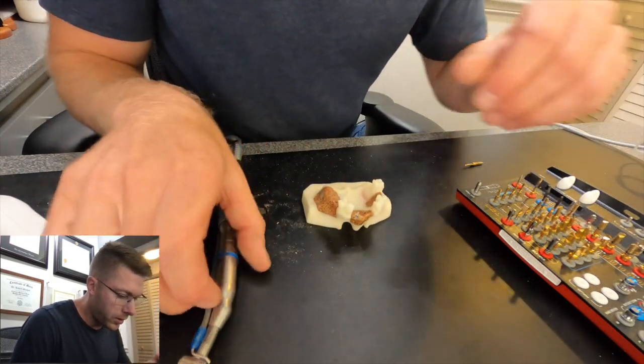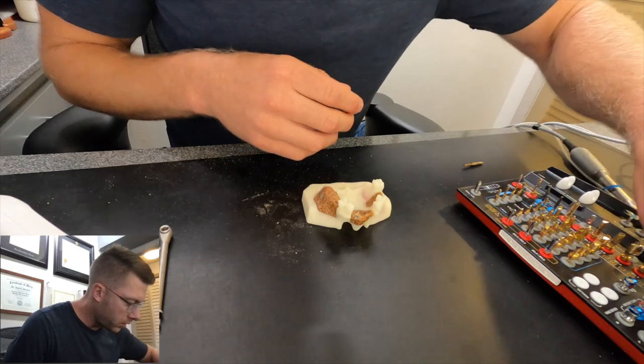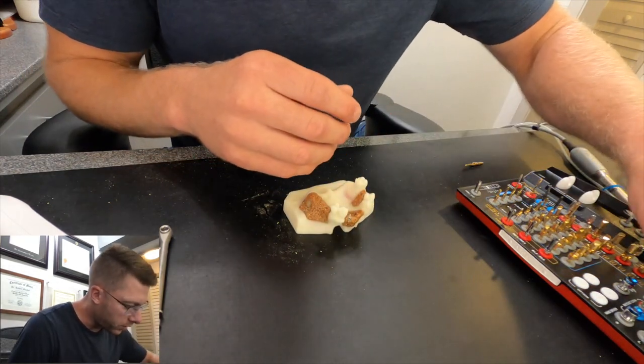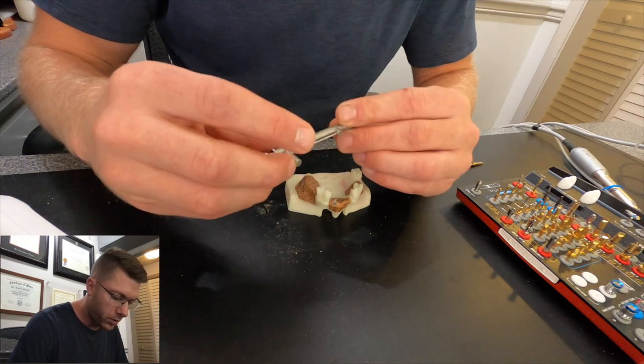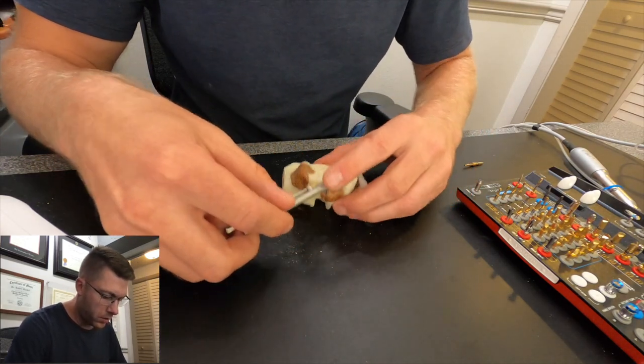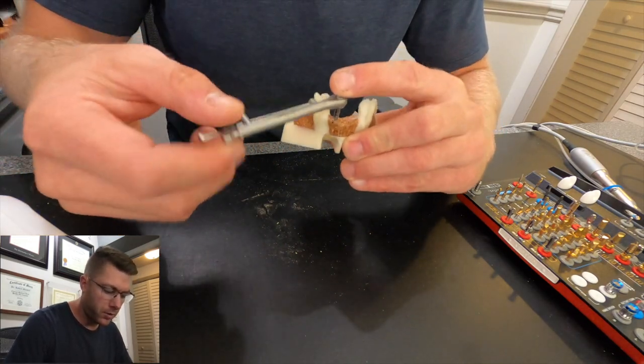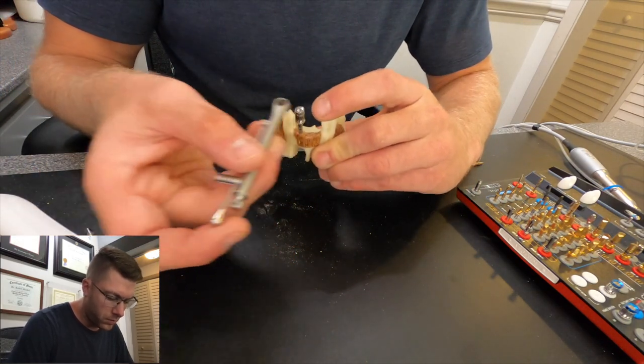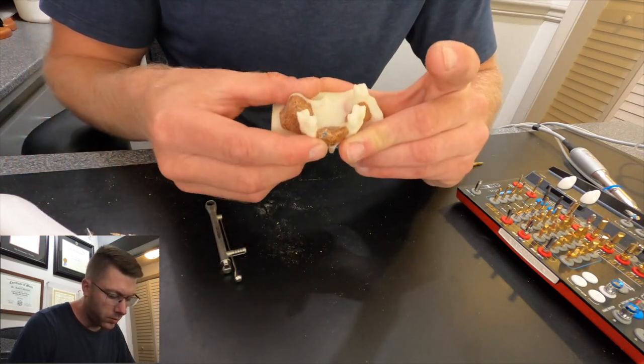Sometimes the implants don't go in all the way, so we drive them in the rest of the way with the hand torque wrench. We torque it to our desired depth. And there it is — there's your dental implant. Now, somebody like an elderly woman with osteoporosis is going to have very low density bone — I'm comparing it to something like drywall. A young male, big and strong, with high density bone, they're going to be more compared to something like wood.